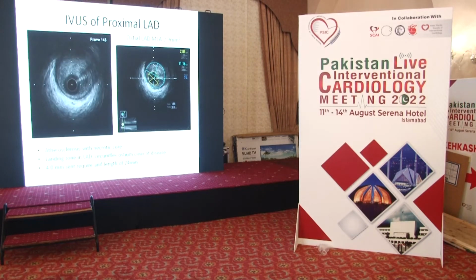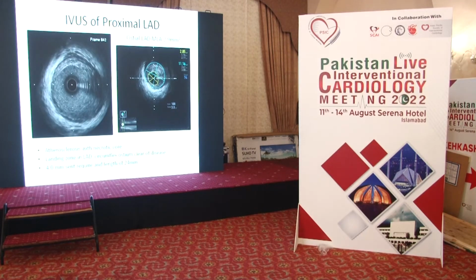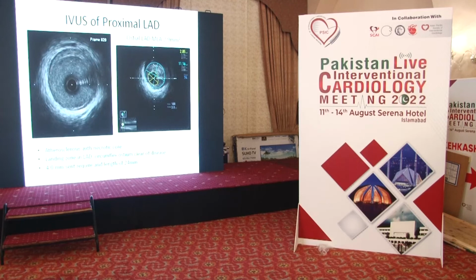Okay, so just try and get your eyes in on this. What you'll appreciate is that this is plaque. This is not a SCAD. And what type of plaque is this, on the classification that we showed earlier? Yeah, soft plaque. So fibrofatty soft plaque.